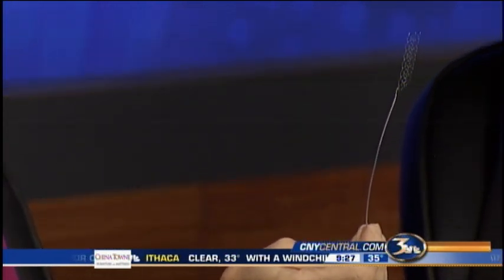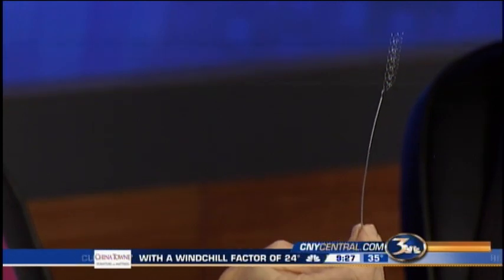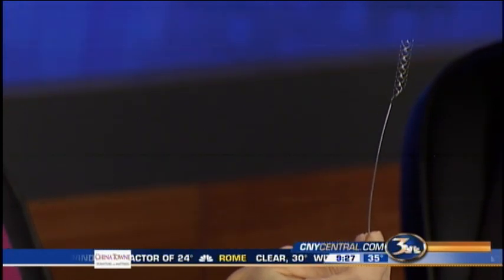Okay. We deploy this across the blood clot. It immediately restores blood flow to that area of the brain. Okay. You wait a few minutes, and then that chicken wire grabs the clot. This mesh, essentially. The stent, and then we're able to pull the clot out. Oh, that is awesome. Which, as you say, restores the blood flow, reduces the risk of paralysis and further complications. That's correct. And there's new data that just came out in the New England Journal of Medicine last month showing that if you use this technique in combination with the clot-busting drug, patients have significantly better outcomes.